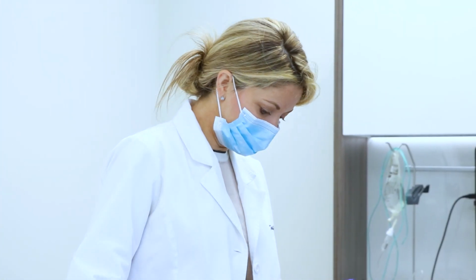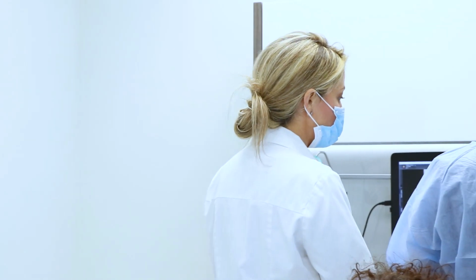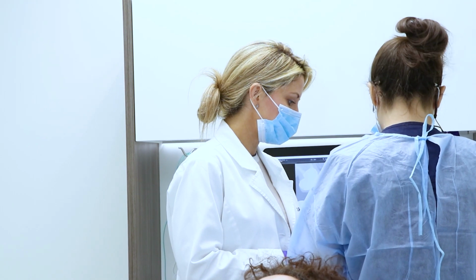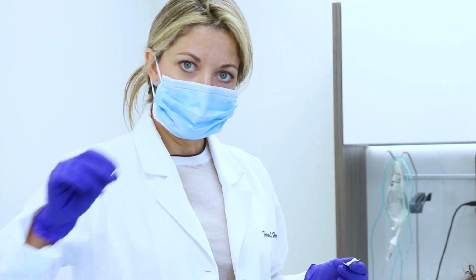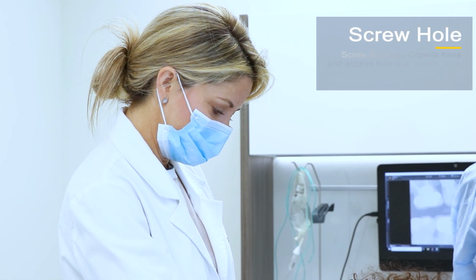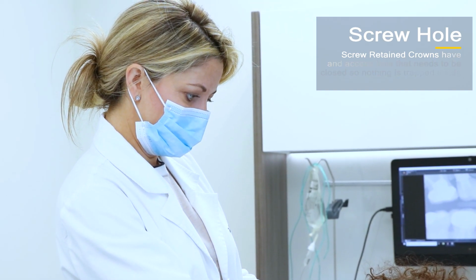So you don't over tighten the screw or leave it too loose. And then we cover the screw hole with something called Teflon. And this will protect the screw from the filling that I'm about to put in. I like to use the driver to put the Teflon. And Teflon is antibacterial, and that's why we use it. In the old days, we used to use cotton.